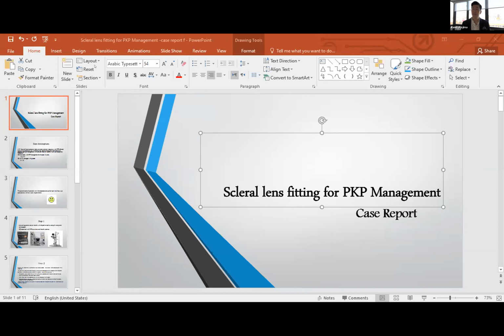A soft lens, I believe the study indicates that it takes like 30 minutes, forgive me for not remembering 100%, but even soft lenses exchange a lot of their fluid within a relatively short period of time.